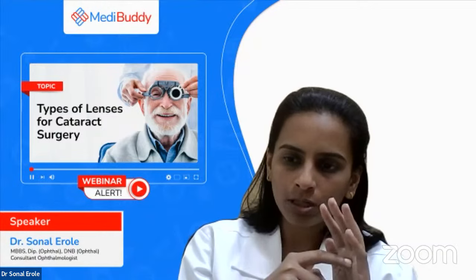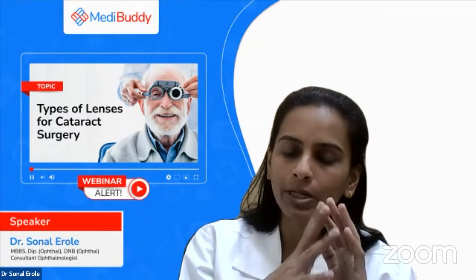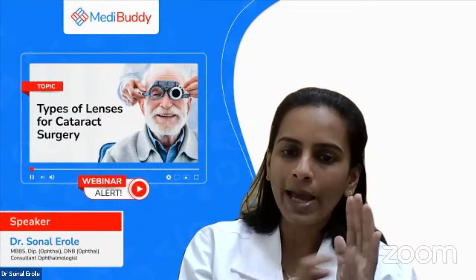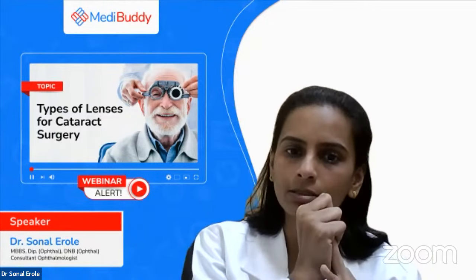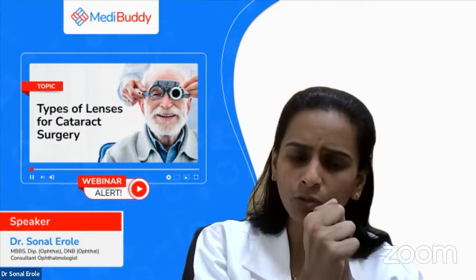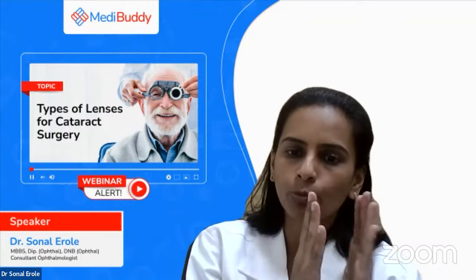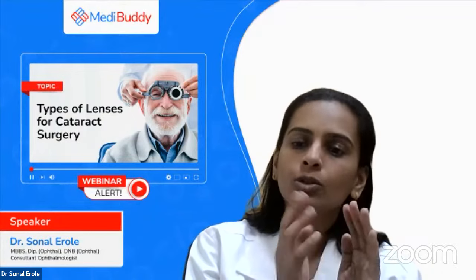The cataract operation is not repeated basically. You can go for removing the lens and putting the normal lens, but it does have its own side effects, like the bag can get compromised because there are strong adhesions between this bag and the lens once we have put it. After 1.5 months, it is nicely fixed over there. To remove it and replace it with a monofocal lens is definitely not an easy operation. It can be done, but it is not an easy operation.